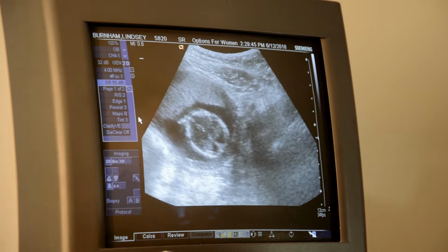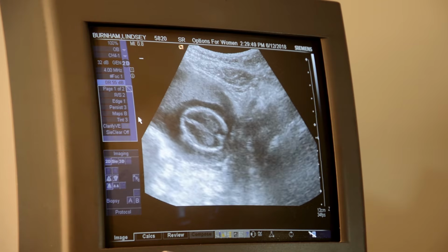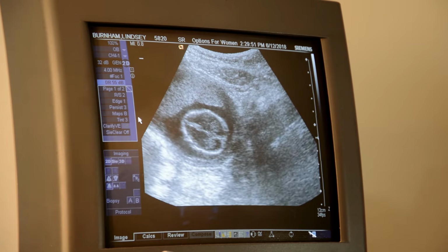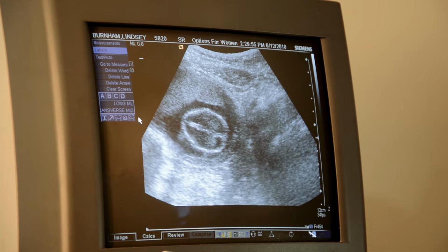I'm looking for that. Yeah, he's kind of looking up. He's not really in good BPD. Oh, he's starting to get there. Ooh, say turn, turn. Look at him turn for you. Good. Would you take that? Yeah, because you can see that line right there. Beautiful. Yes, the head.